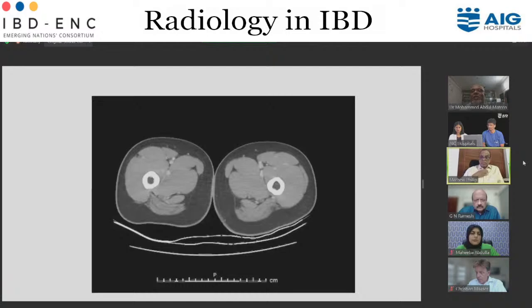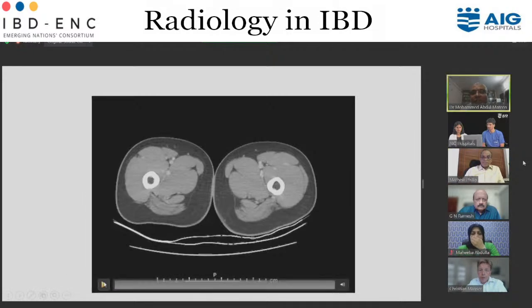Professor Christine, on this, can we get any ultrasound? Bowel ultrasound will help in this one, while Professor Mateen is answering this. On ultrasound, it is difficult to say whether it's inflammatory or neoplastic. We can just say that there is a thickening of the lower part of the body of the stomach and pylorus with narrowing.